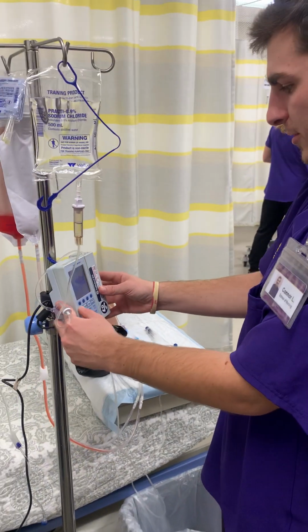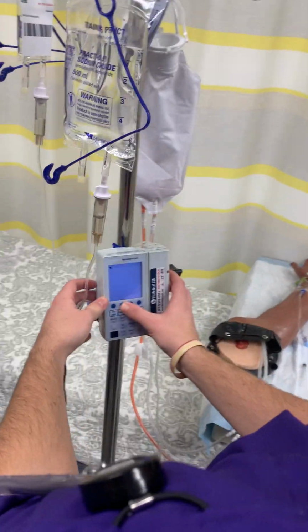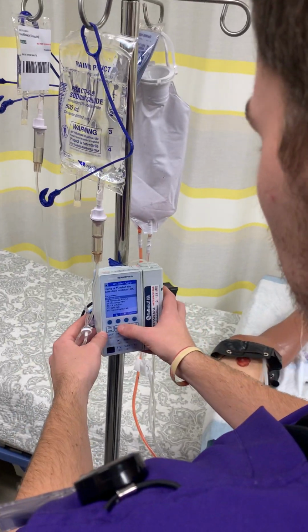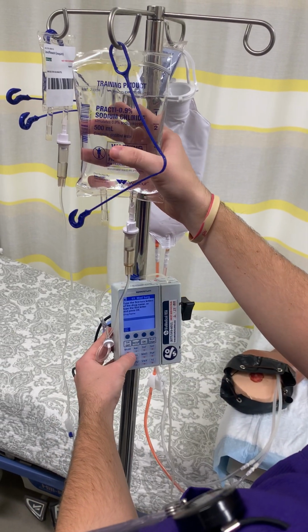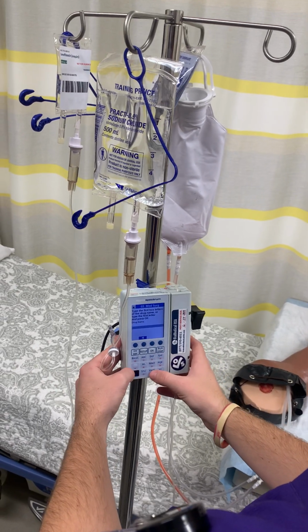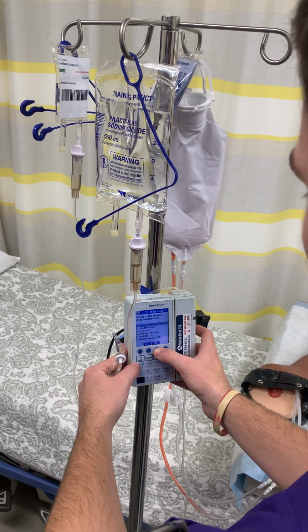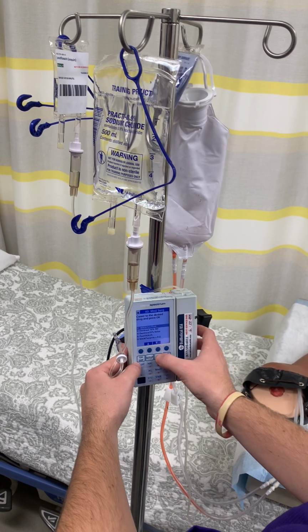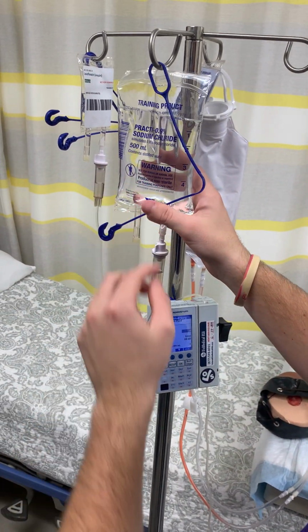I'm going to turn on the machine here. And I'm saying, yes, this is a new patient. So I'm going to click on Med-Surg, and we're putting in our IV. So I'm going to put IV. All right, and then we know this is maintenance fluid. So I'm going to click on that. And here we have 500 milliliters.